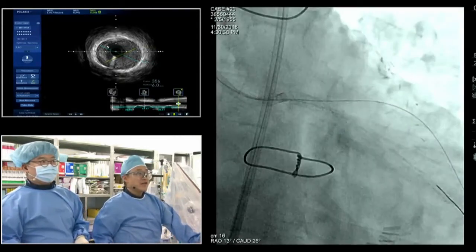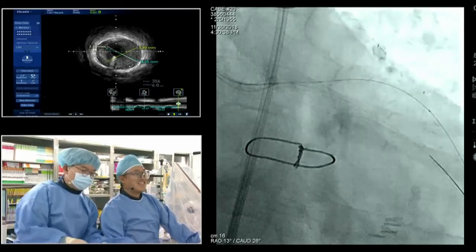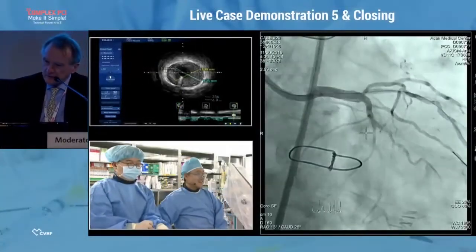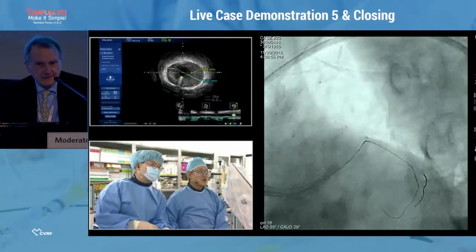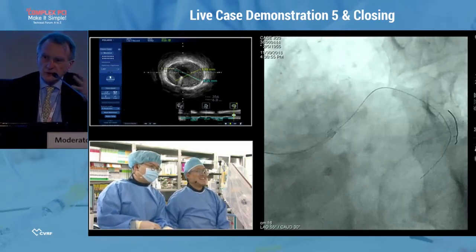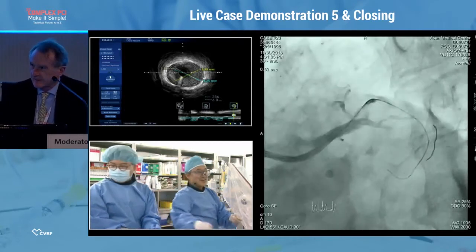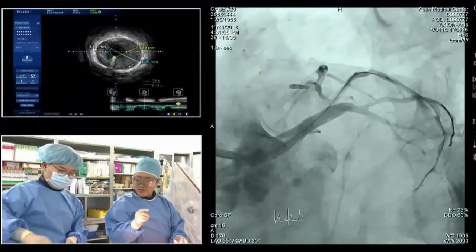Okay, beautiful to see. PCI well done. It's not easy to see. Antonio really likes it. Thank you. Okay, good. It's like when you see a beautiful new movie, you read a nice book, something gives you pleasure. Antonio, really appreciate your comment today. No, I think it's very simple. You go to meetings, you don't see the things anymore. They just need to finish. Bing, boom, bang, finish.